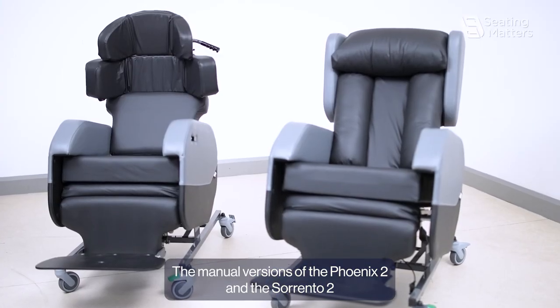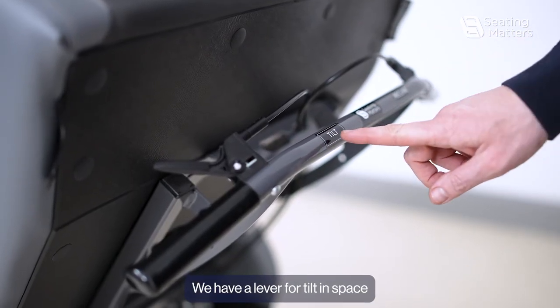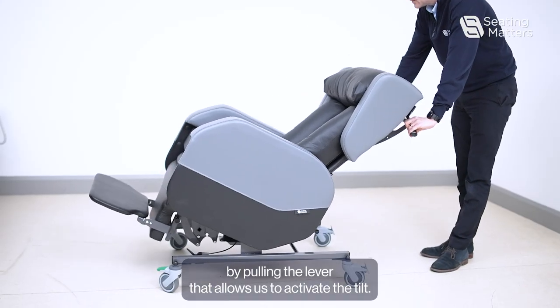The manual versions of the Fenix 2 and the Sorrento 2 are controlled from the levers. We have a lever for tilting space. By pulling the lever it allows us to activate the tilt.